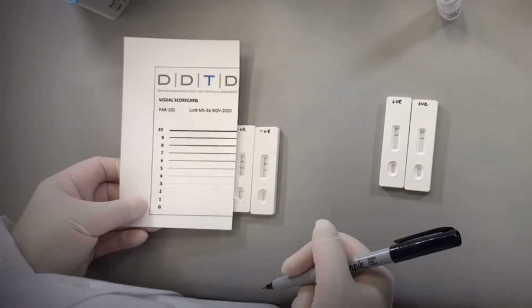Note that the intensity of the test line can be quantified with a visual scorecard. Place the test as close as you can to the visual scorecard and assign a number. To be considered positive, the test line intensity in the presence of mycolactones should be at least 3 shades weaker than in the negative control.